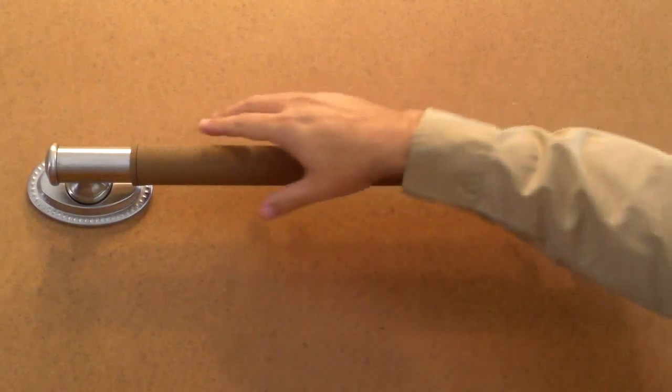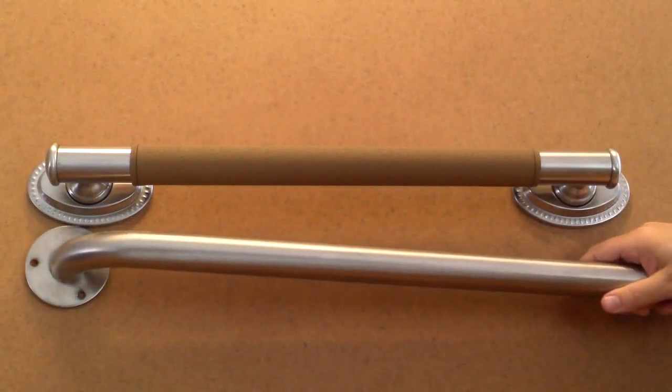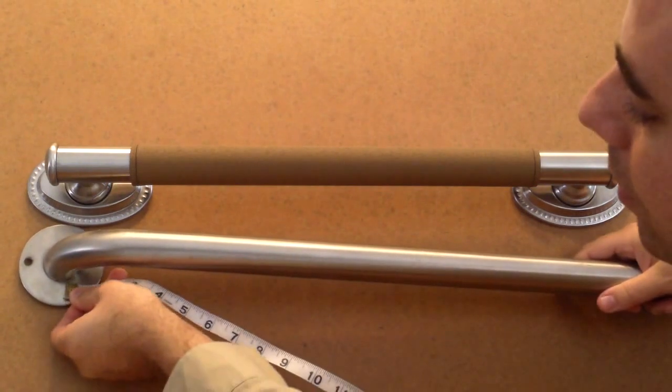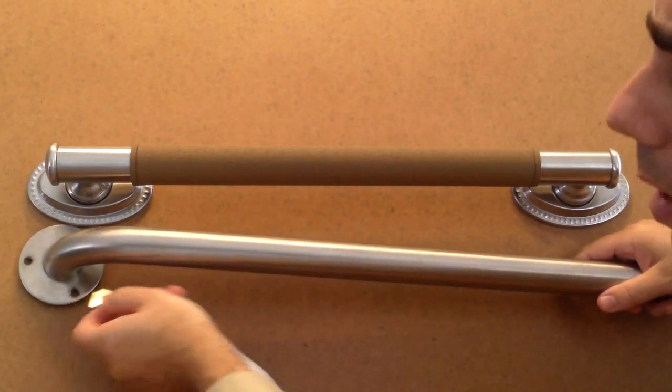Not all grab bars are straight. Some of these are curved. And what we do in that case, we measure from the center of this post to the center of the opposite post.